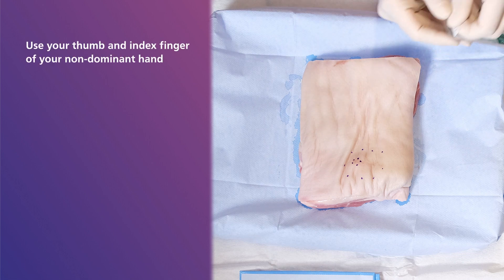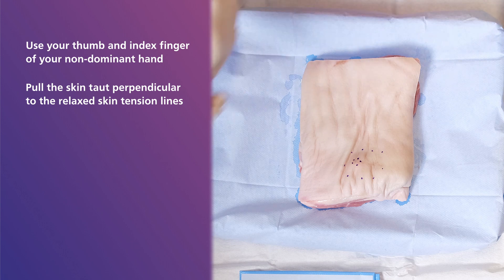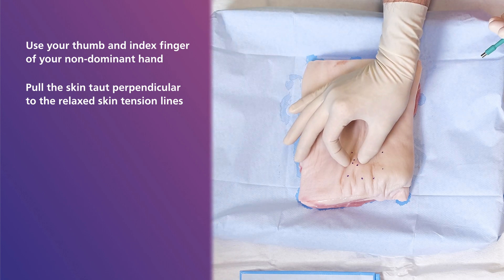Now, using your thumb and index finger of your non-dominant hand, pull the skin taut, perpendicular to the relaxed skin tension lines, as you can see here.